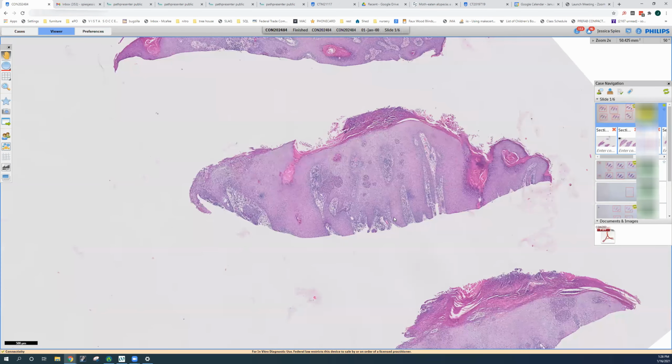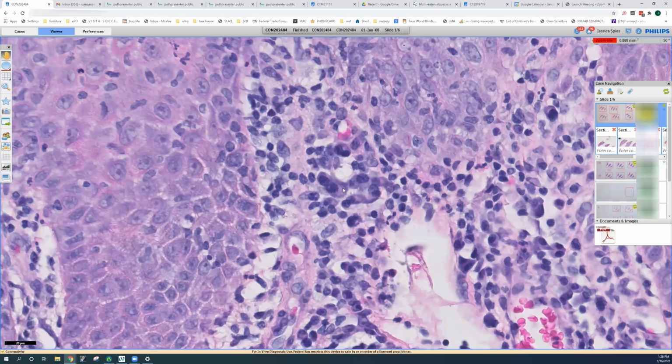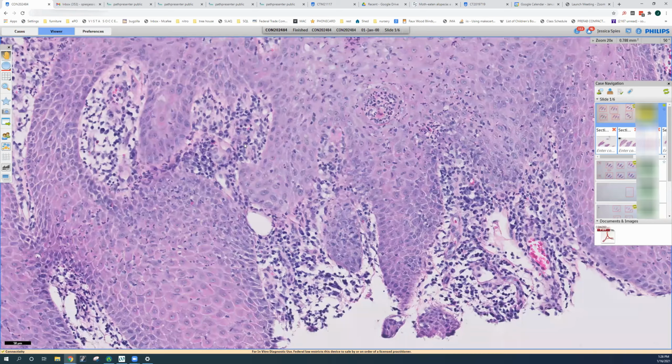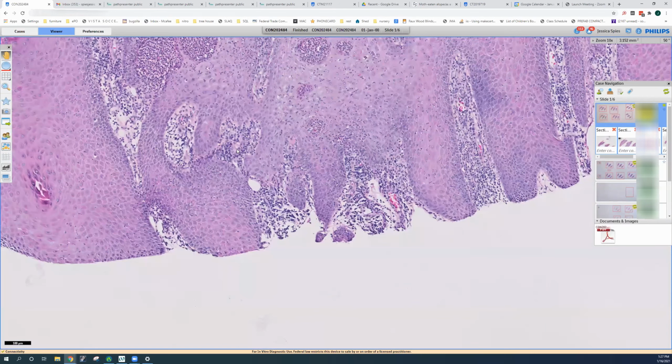And let's go back and see, there are lots of plasma cells in this biopsy. Here we go, here they are. These eccentric nuclei with the clock face and the perinuclear hof filled with immunoglobulin. Again, skin near mucosal surfaces can have plasma cells, but this large number of plasma cells is a little bit unusual. The diagnosis rests on identifying the spirochetes on immunohistochemistry, and it will be present in condyloma lata.